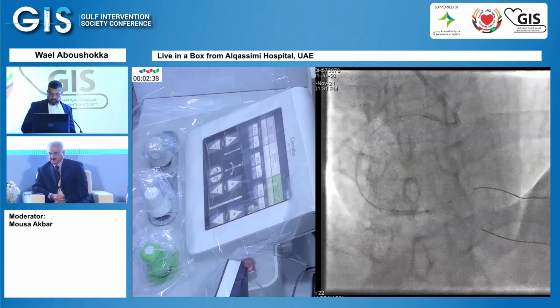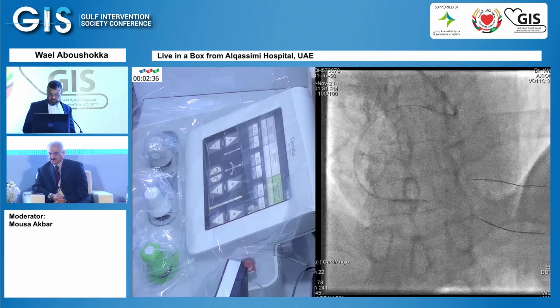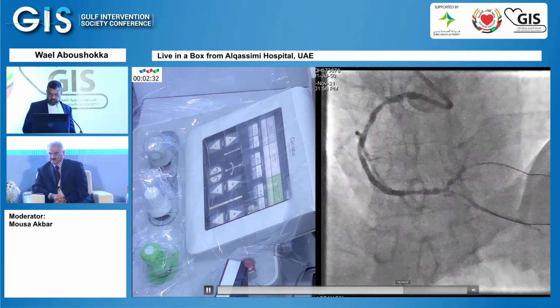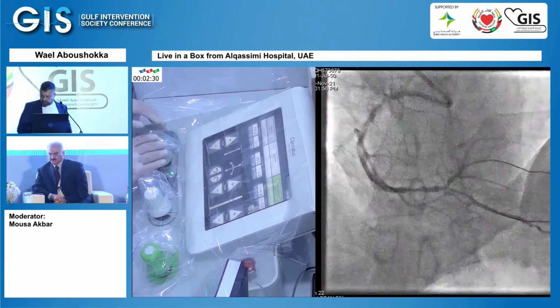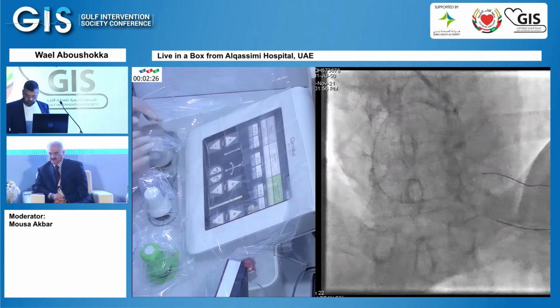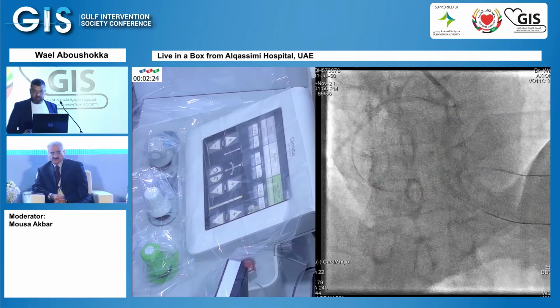Okay, 14, 16 down. Yes, please. Okay, I can go a little bit inside. Okay, we go 16 again.